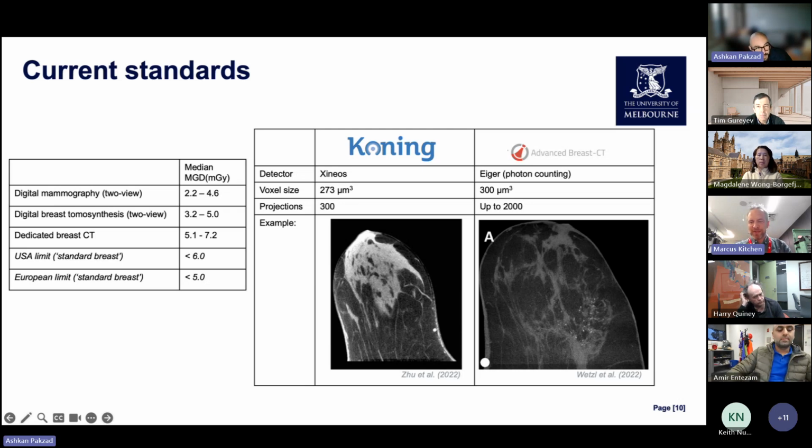So I would say in training, it probably sees images with those streak artifacts. If you were to go very low, you would see those streak artifacts. And then in evaluation, I think it's always best to have that highly sampled reconstruction. So in our study, we trained on 24 milligray, so what was going into the model was reconstructed from 800 projections.